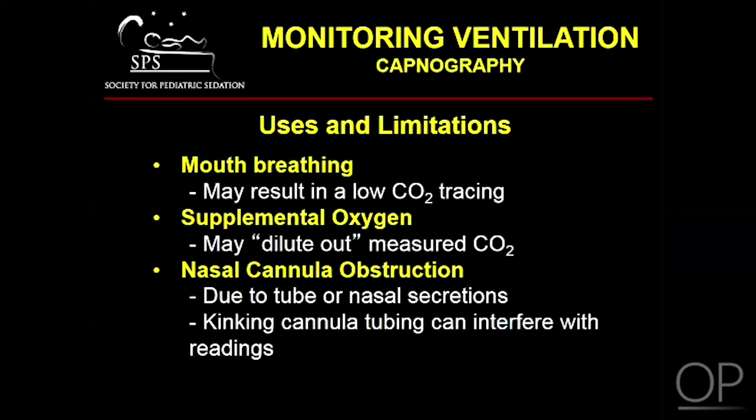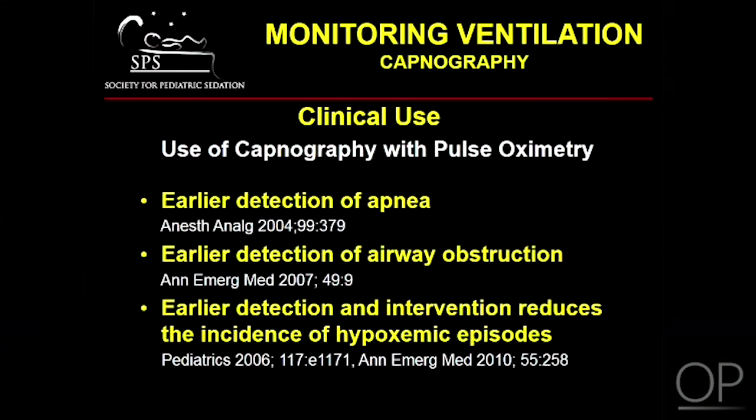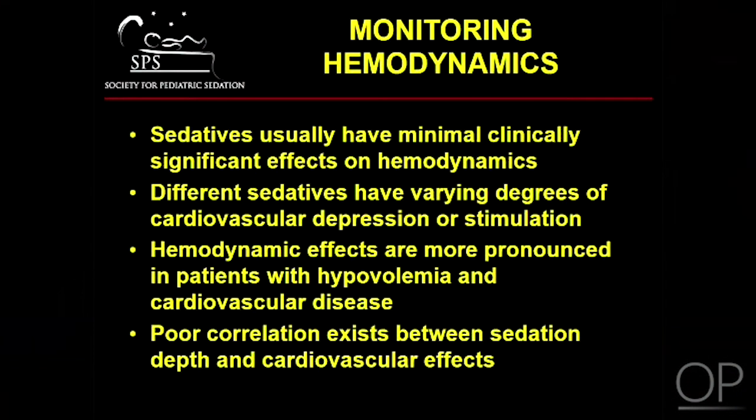intermittent or absent readings. Despite these limitations, numerous studies have indicated that capnography monitoring when performed in tandem with pulse oximetry, results in earlier detection of apnea and airway obstruction, and can lead to swifter intervention, ultimately leading to a reduction in hypoxemic episodes. When considering hemodynamic monitoring, it is important to remember that sedatives usually have no to minimal clinically significant effects on hemodynamic status. This effect, however, is drug-specific.